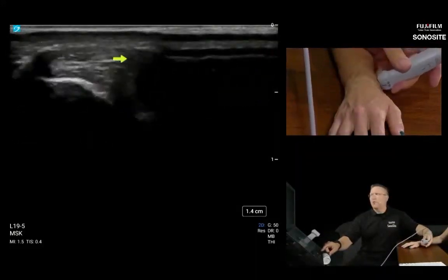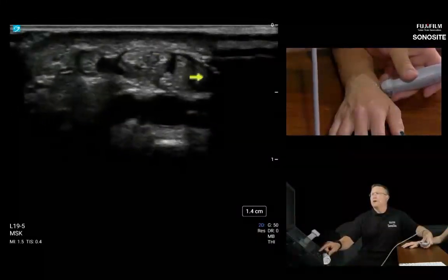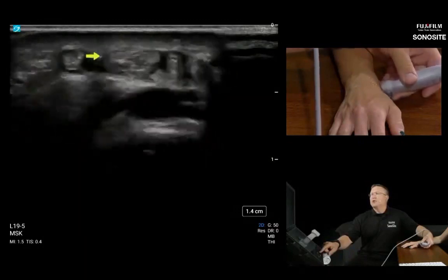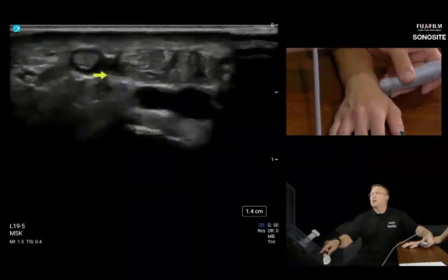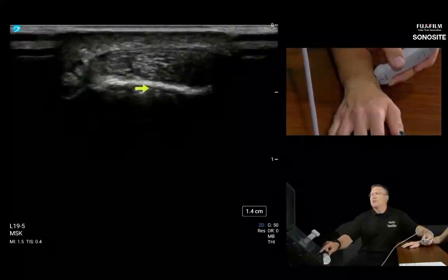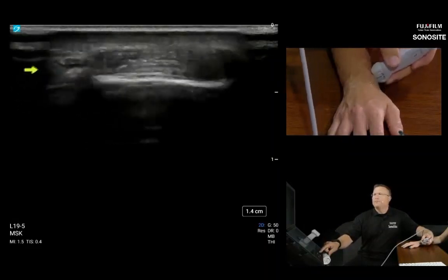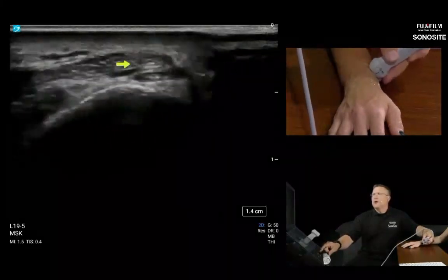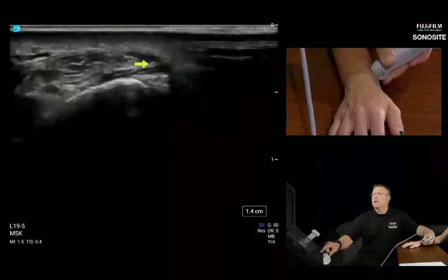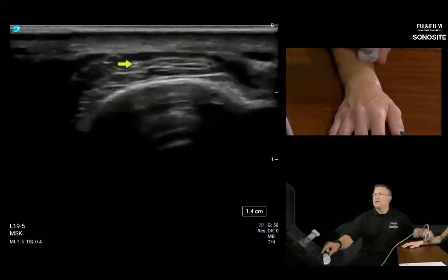I'm on compartment 1, so when I go distal to the retinaculum, I'm looking for de Quervain's tenosynovitis. I'm looking for the APL and the EPB to really blow up that synovial thickening or effusion. You can see synovial wall thickening like a big sponge around these, and that is the classic de Quervain's tenosynovitis. Now let's go back to the radius where we see those little tubercles and those little retinaculums. Now let's go proximal, and as we go proximal, I'm going to follow my APL. Let's follow APL first, and see what happens to it relative to the underlying second compartment.